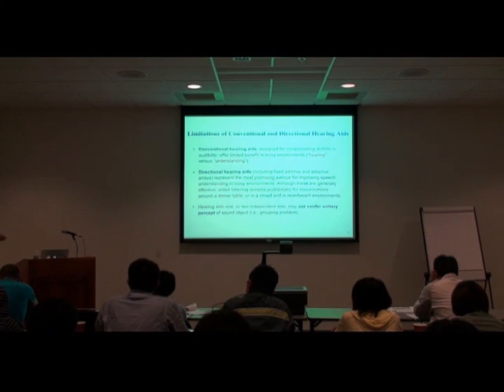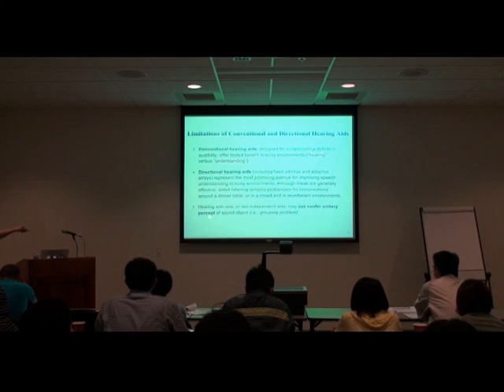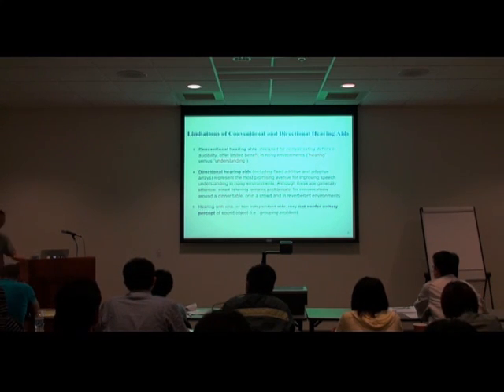Okay, so we have a problem. When you have two independent aids, you have a problem. Or with a single aid, that aid is not performing what the ear normally performs. So you cannot perform this coherent, or unitary, perception of the sound outside.